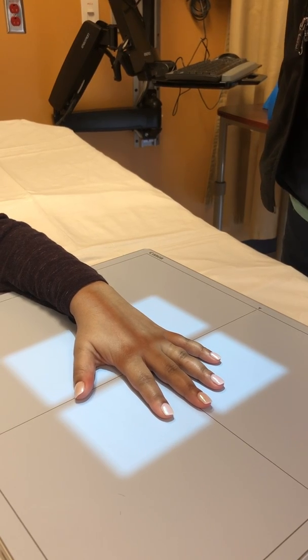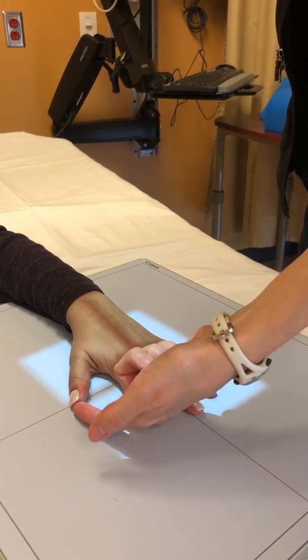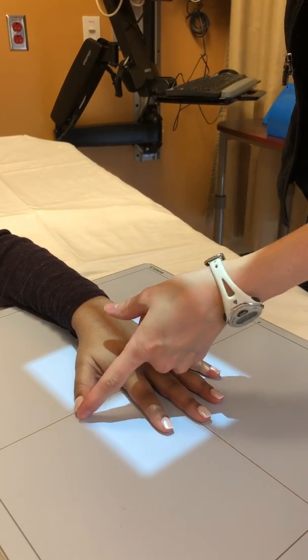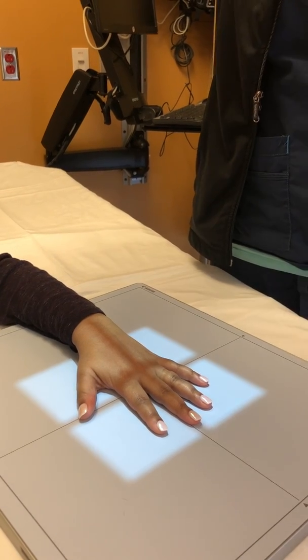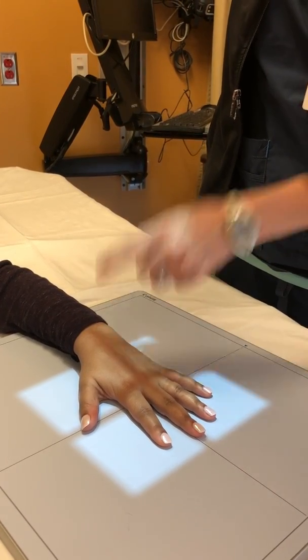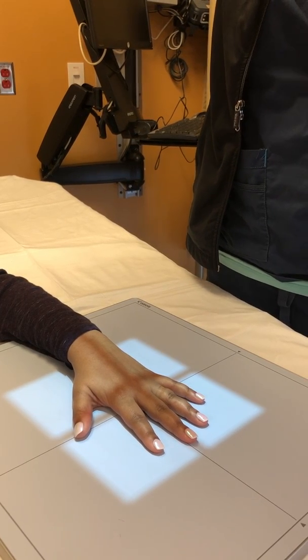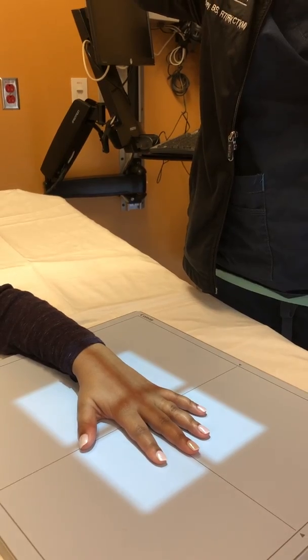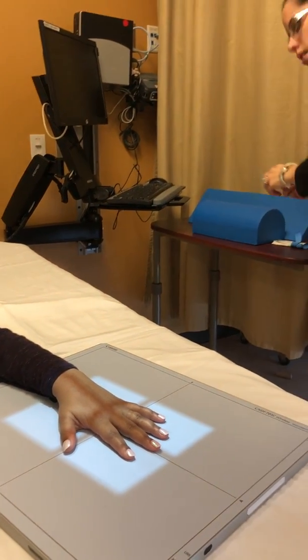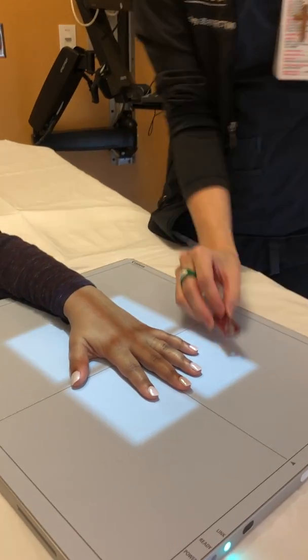The important thing again is to remember not to collimate too much. We don't want to be too close and clip out the thumb. That happens quite a bit. So we want to open up your collimator here, because if we go a little close here, then we don't have enough wrist either. You want about the distal third of the wrist itself. Okay, that would be how I would position our patient, and this is where I'm going to put my marker.